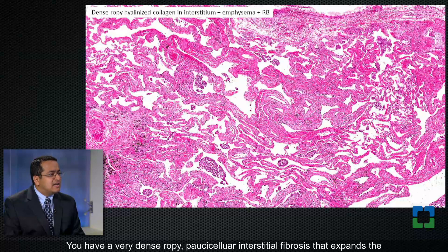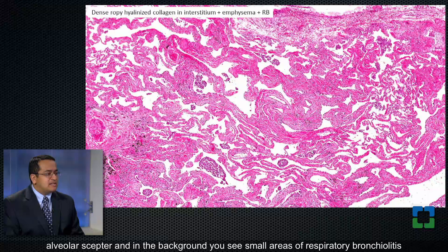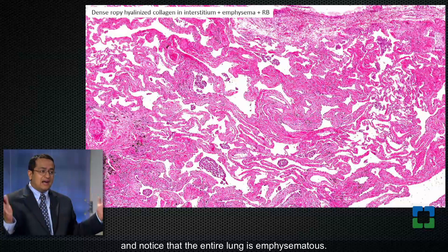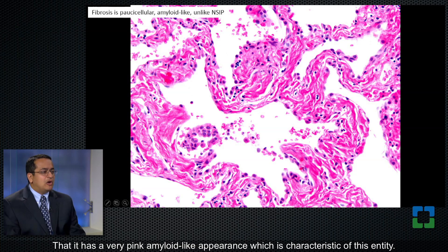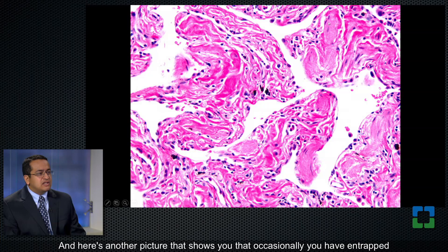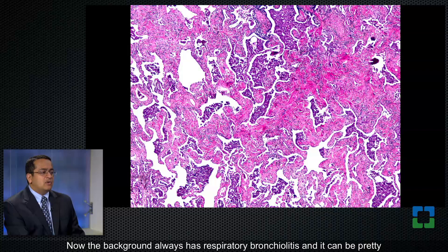Here's what SRIF looks like pathologically. You have a very dense, ropey, paucicellular interstitial fibrosis that expands the alveolar septa, and in the background you see small areas of respiratory bronchiolitis. Notice that the entire lung is emphysematous — so this is not just pure emphysema; it's emphysema with a particular kind of fibrosis. At high magnification, the fibrosis has a very pink, amyloid-like appearance which is characteristic of this entity, and occasionally you see entrapped smooth muscle bundles mixed with this kind of fibrosis.